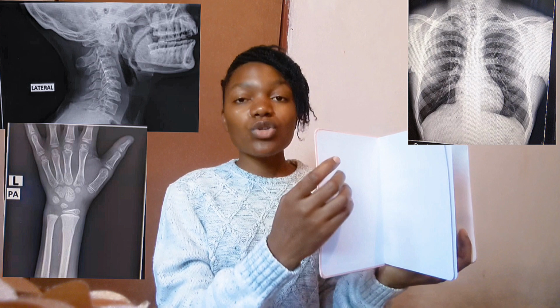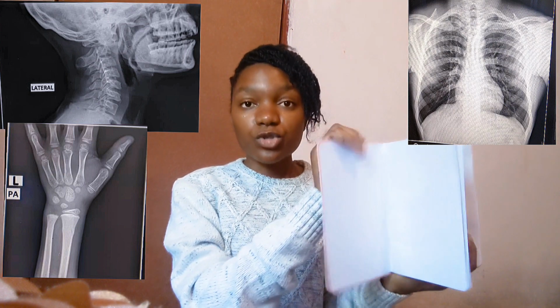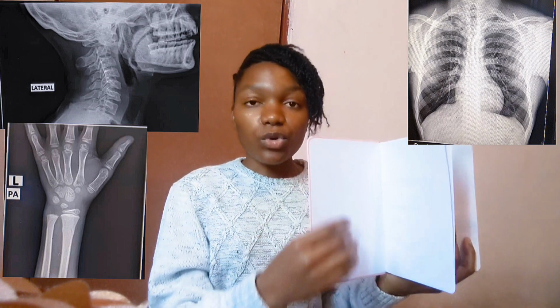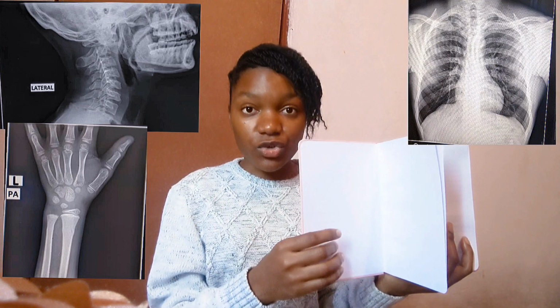So a lot of energy is going to be absorbed in here, and it won't reach this part, so it's going to show white on an x-ray.